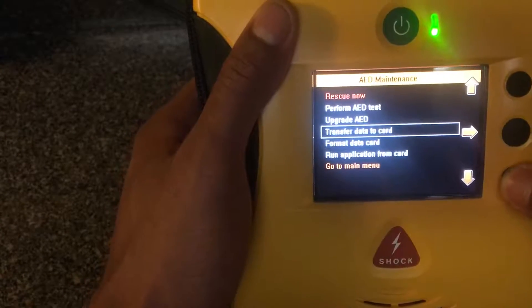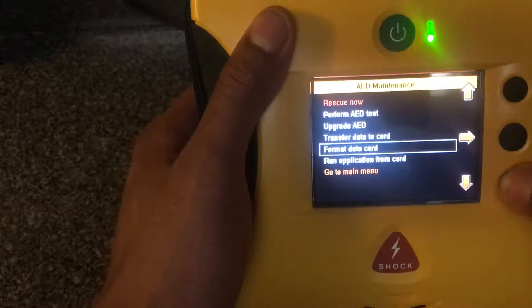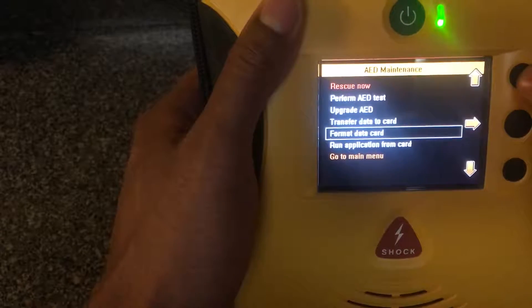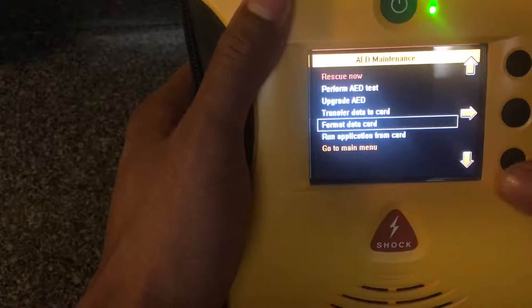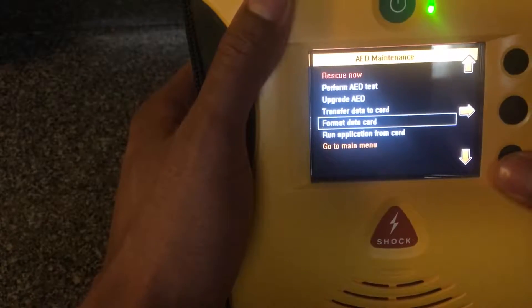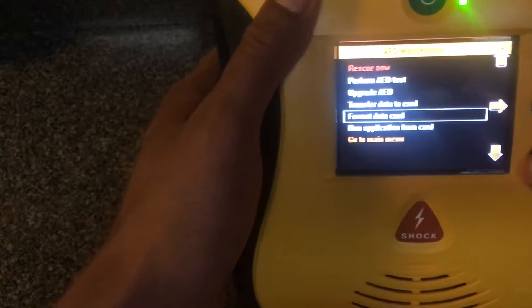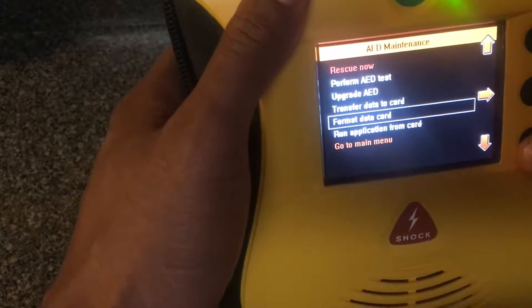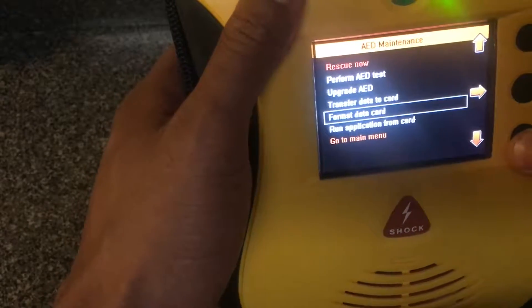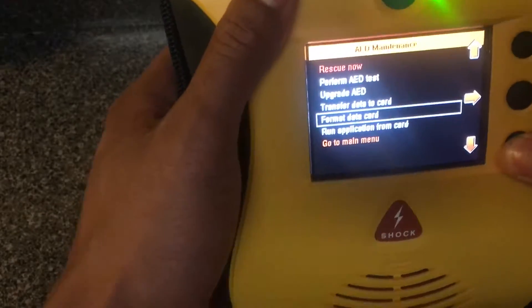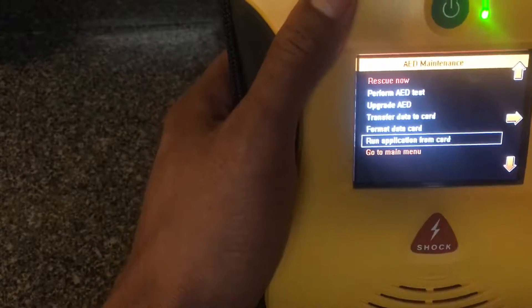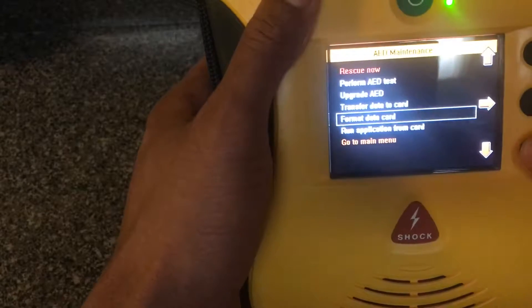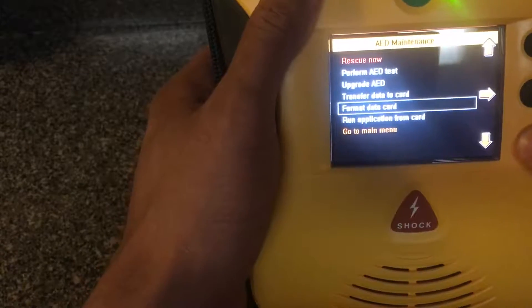You can transfer the information to a memory card and ship it back to Defibtech to analyze. Then you have the format data card. This is what you do: format data card completely erases whatever data was on the card so you can use a fresh card, pretty much.